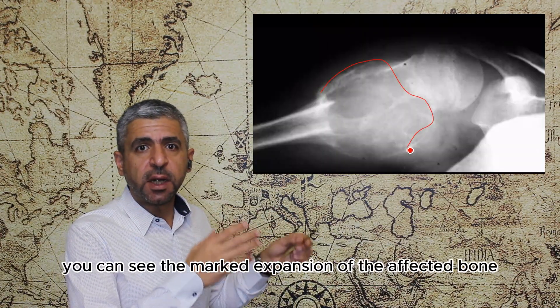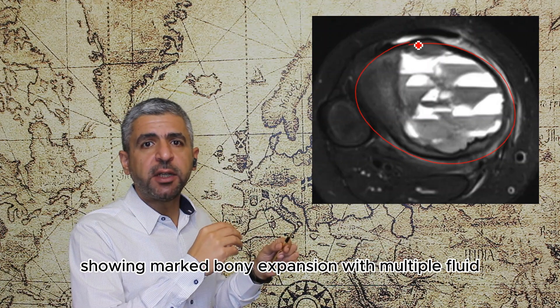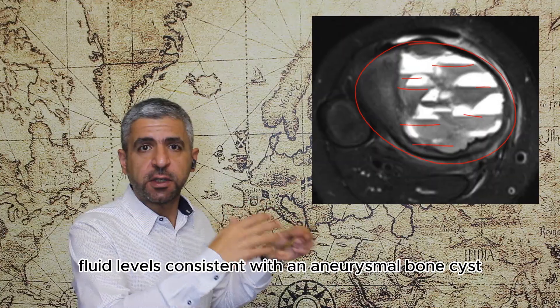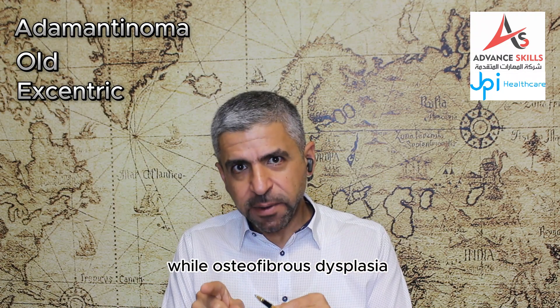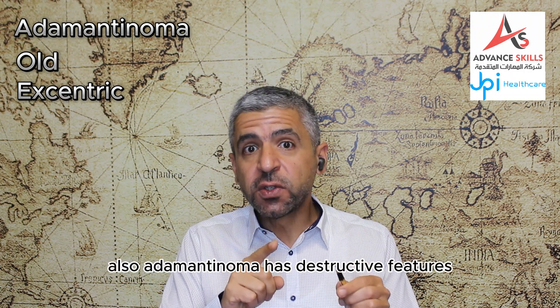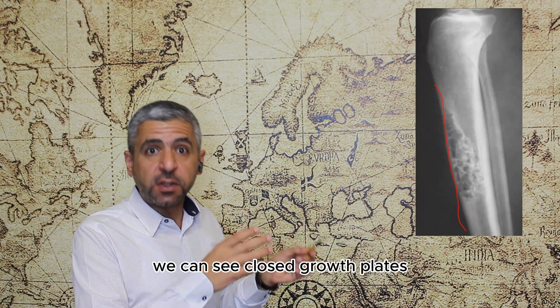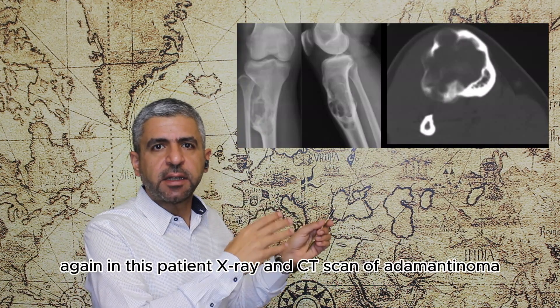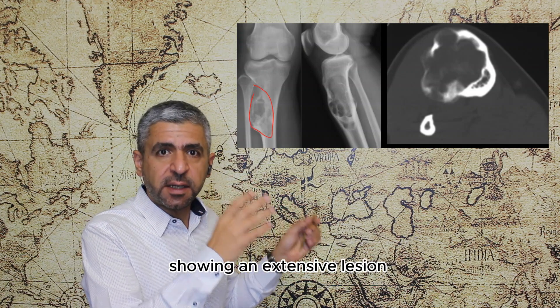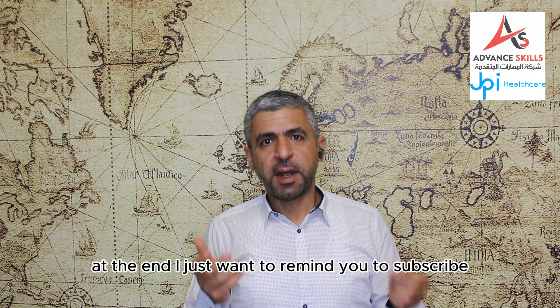Aneurysmal bone cyst shows marked expansion of the affected bone with fluid-fluid levels on MRI. Adamantinoma is seen in older patients, is eccentrically located, and has destructive features, while osteofibrous dysplasia involves the anterior tibial cortex. Examples of adamantinoma show closed growth plates indicating an adult patient, an eccentric location, and a destructive pattern of bone involvement on both X-ray and CT scan.